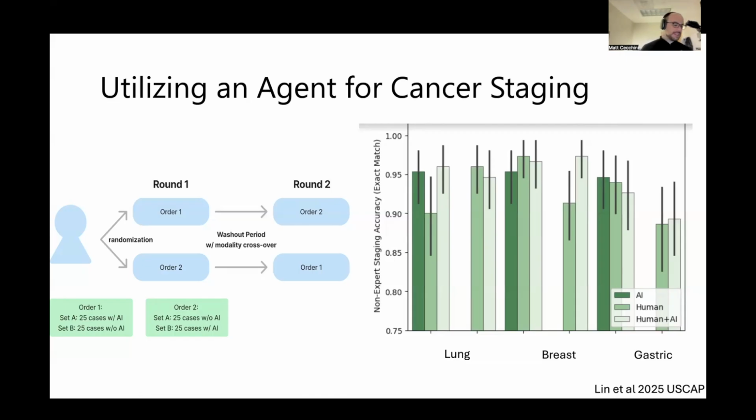There's some bias here, right? One is the automation bias. If the AI is doing a decent job at something, it's not really effective to just give that output to the human and say, hey, check this all just in case there are any errors.